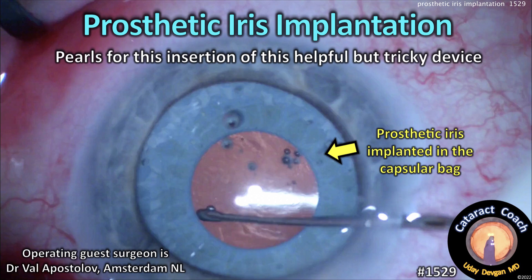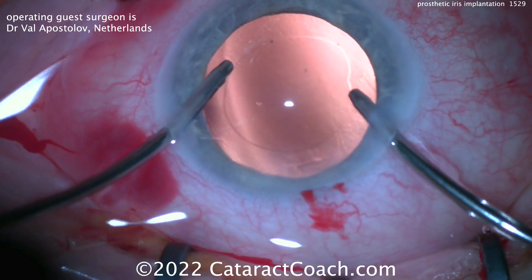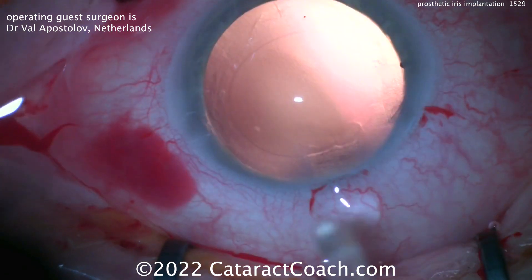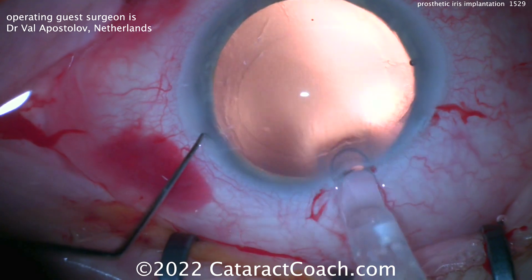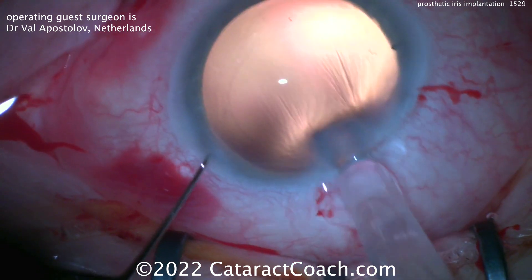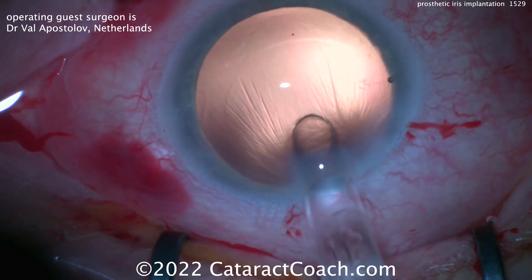CataractCoach.com — prosthetic iris implantation: pearls for insertion of this helpful but tricky device. Our guest surgeon here is Dr. Val Apostolov from the Netherlands. You can see the patient has already had the cataract removed, there's a nice capsulorrhexis, and here comes the IOL. The patient has traumatic mydriasis.